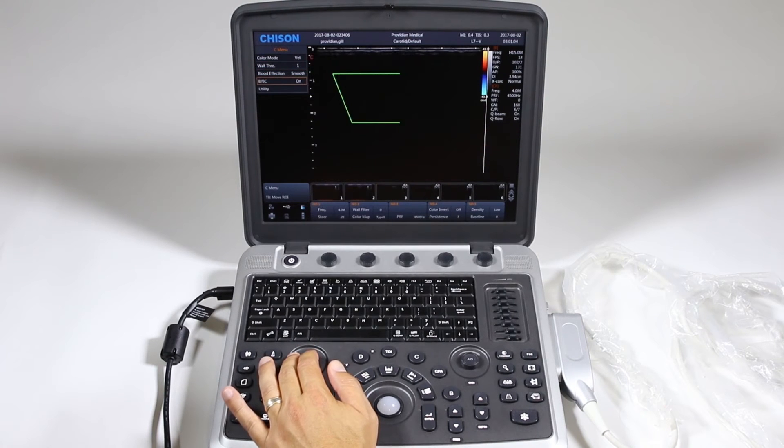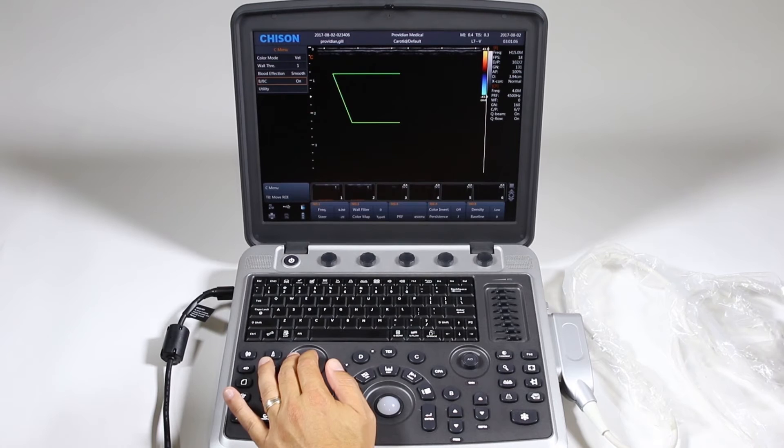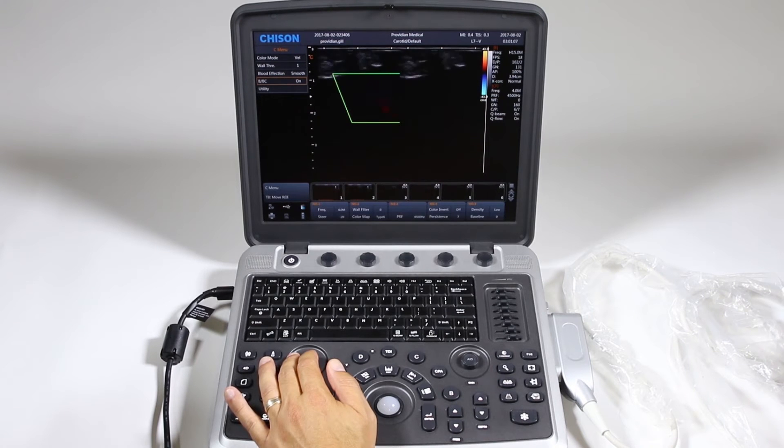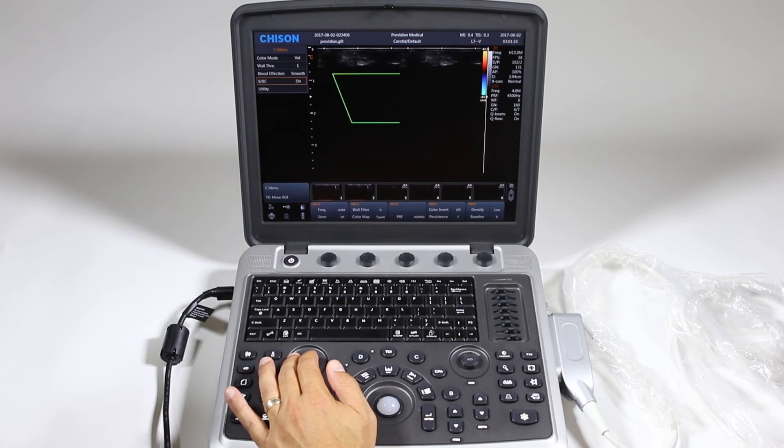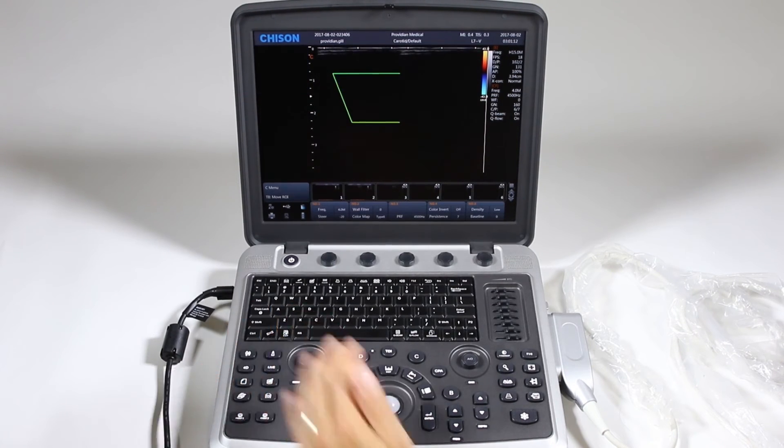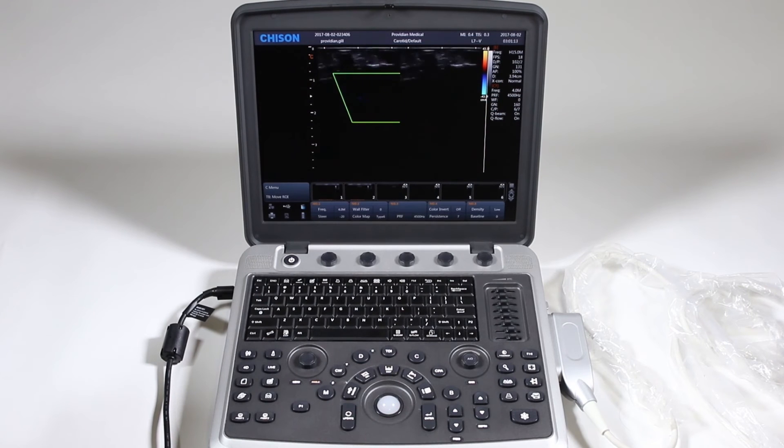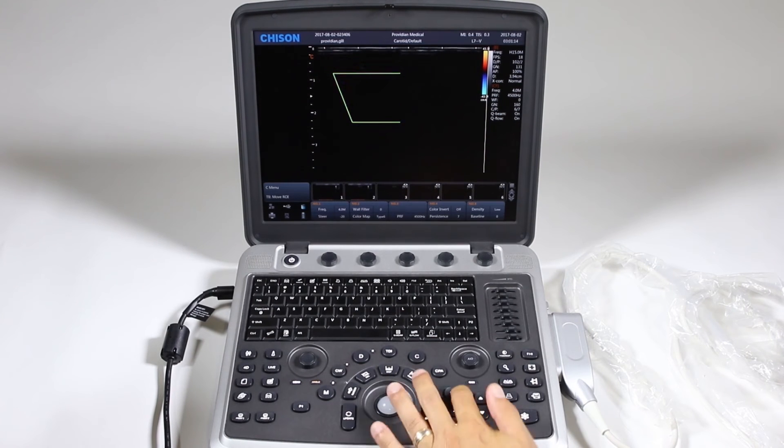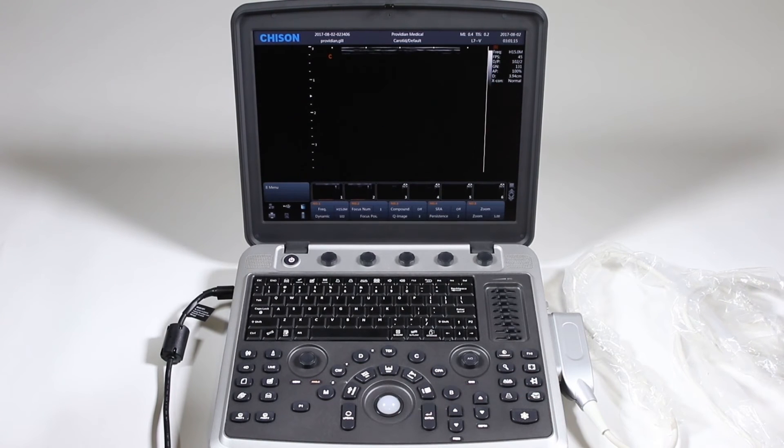BBC, that gives you a split screen. You've got color on one side and 2D on the other. We'll just go ahead and click exit to get out of that. We'll go back to B mode.